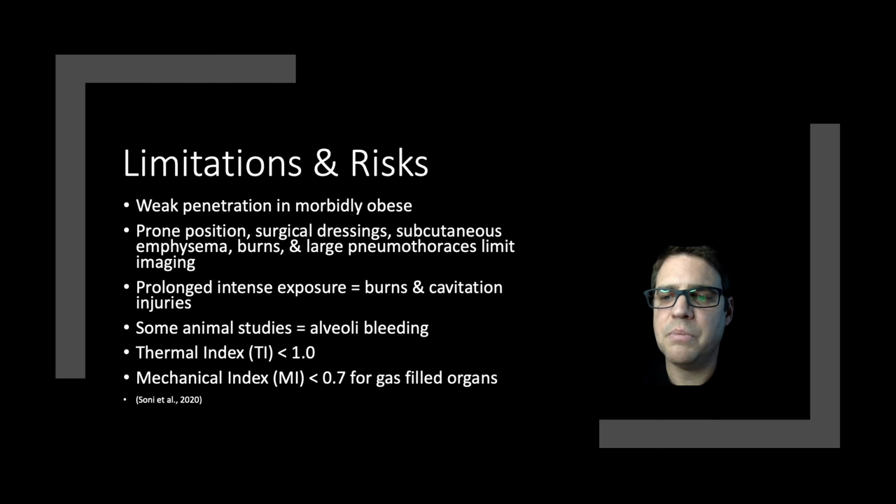Because of these risks, modern ultrasound machines have mechanisms in place that are designed to reduce the risk of thermal and mechanical injury. Thermal injury is monitored by thermal index, TI, and it's to be kept below 1.0.